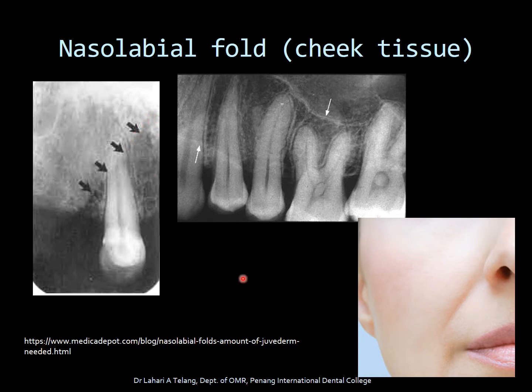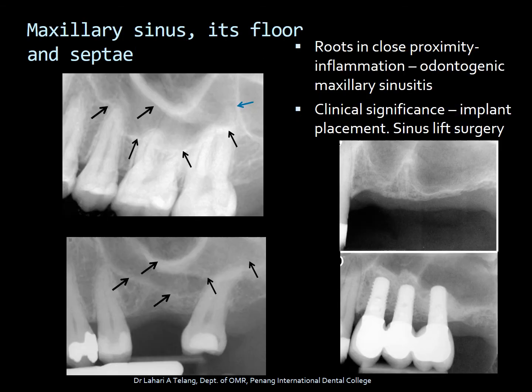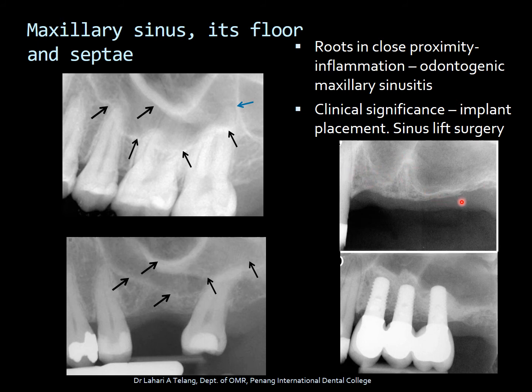The nasolabial fold is the fold on the cheek that is visible, and cheek tissue gives the appearance of a soft tissue radiopaque shadow on maxillary radiographs, especially in the canine-premolar region. Moving on to the maxillary sinus — an important landmark. In the maxillary posterior region, the roots of the premolars and molars are in close proximity to the sinus floor. Occasionally, odontogenic infection in the maxillary molar roots, especially the palatal root, can inflame the sinus floor and lead to odontogenic maxillary sinusitis. In an edentulous area, the sinus floor generally dips lower, which is of important clinical significance when placing an implant.